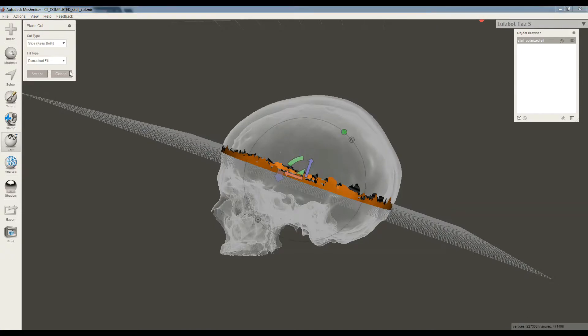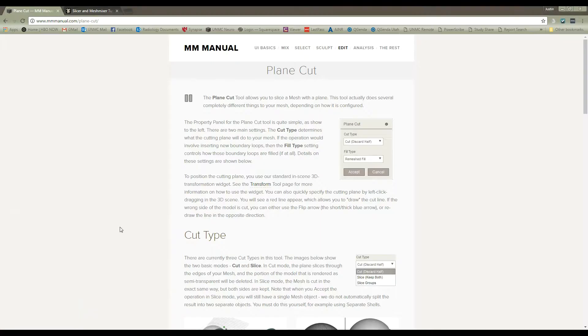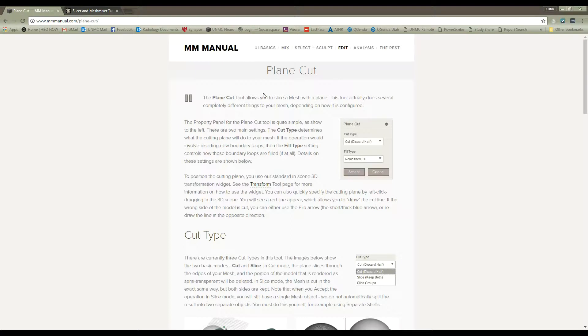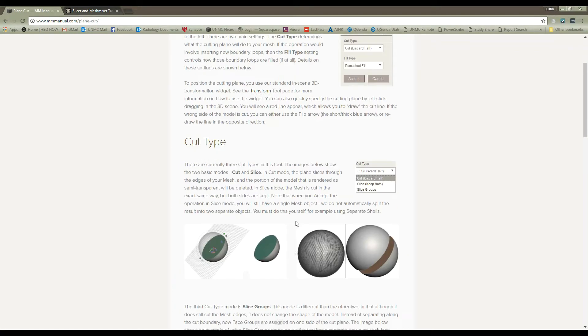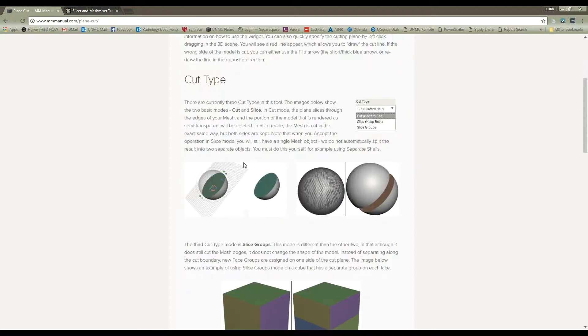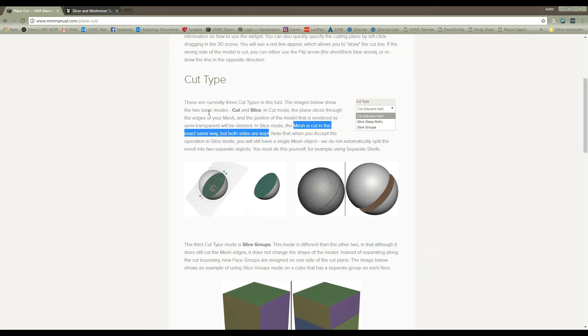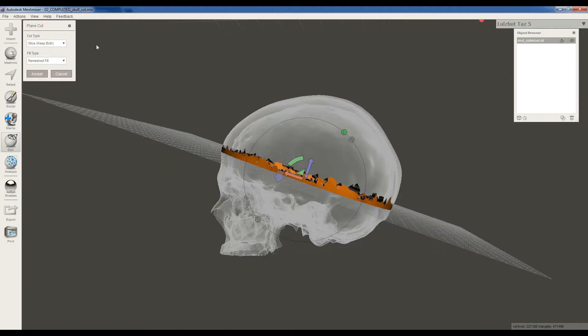So let's take a look at our options with Plane Cut. Now, something that's helpful with Mesh Mixer is that it's very well documented. You can pretty much just type into Google the name of the tool in Mesh Mixer and it's going to take you to the relevant Mesh Mixer manual page. So this is the page that describes all the options for Plane Cut. You can see there's two main options, the Cut Type and the Fill Type. If you look here, the Cut Discard Half is going to get rid of half your model. The Slice Keep Both, the Mesh is cut in the exact same way, but both sides are kept. That's what we want. We don't want to get rid of any part of our model. So our Cut Type is going to be Slice Keep Both.